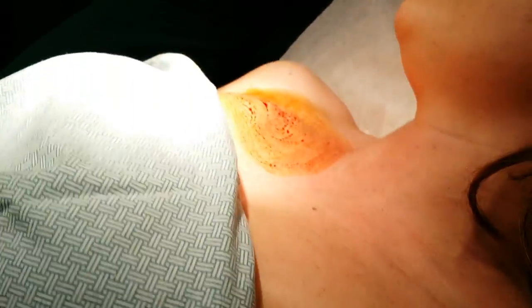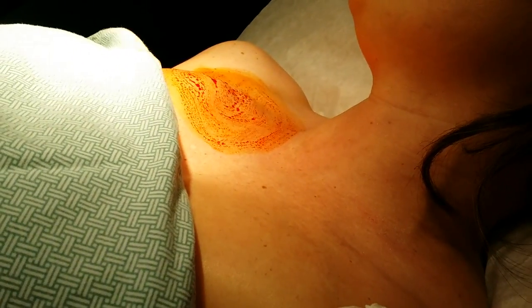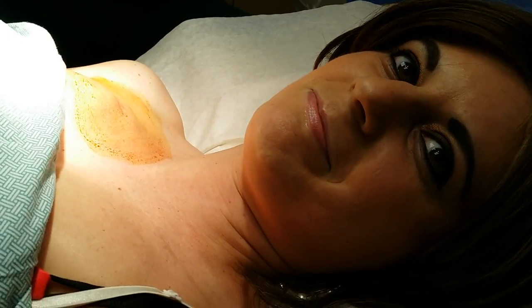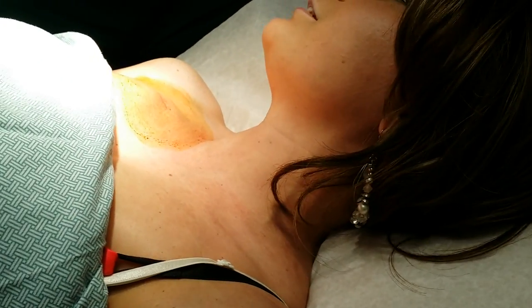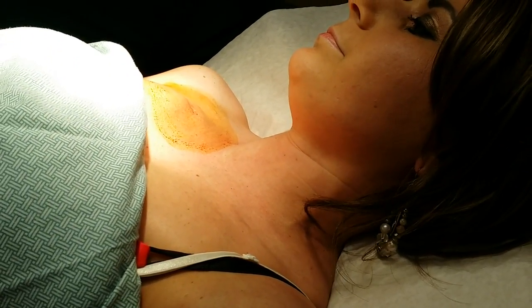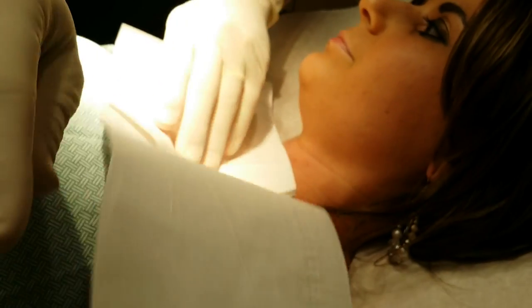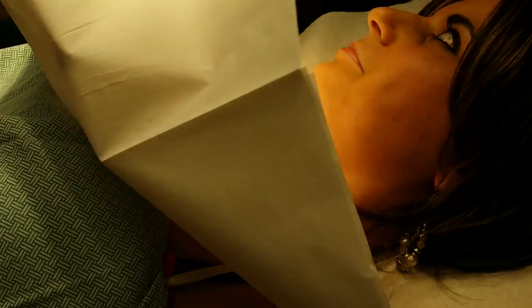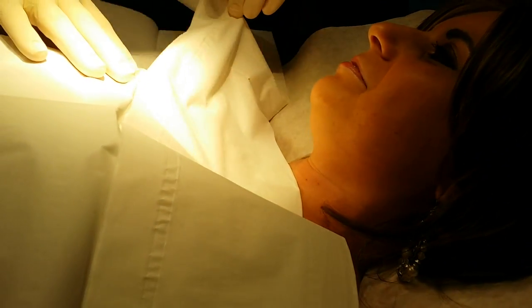Every stitch we put in today will be completely absorbable, so it'll just dissolve away. I'm going to cover you a little bit, just to make this area semi-sterile. If you're a little claustrophobic, just turn your head that way and you can breathe out to the side, because this is going to cover your face just a little bit.